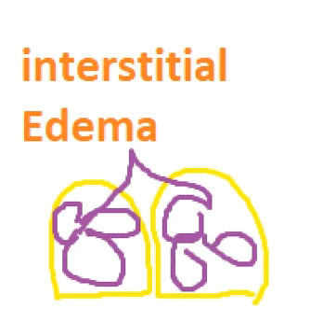Fluid starts to accumulate within these interlobular septa, and when it accumulates, these septa become more and more thick.